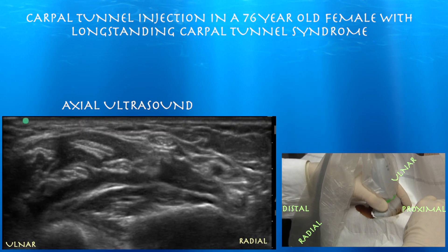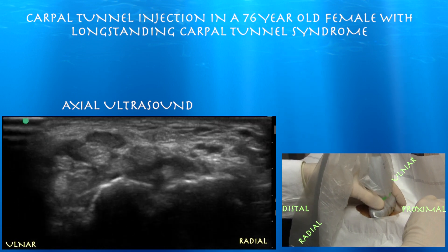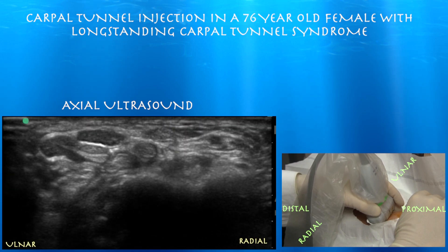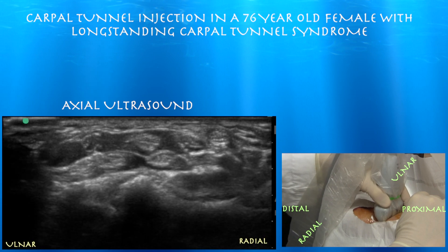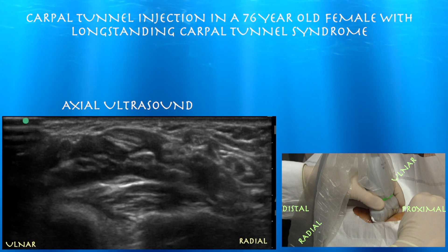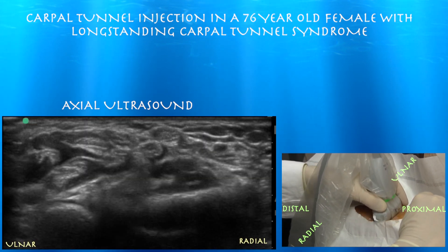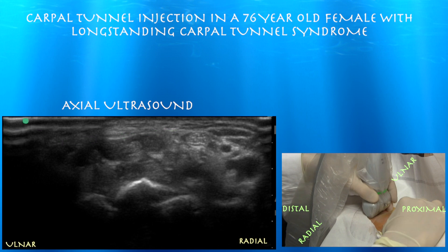Back towards the wrist, the nerve itself is pretty big. You can appreciate the flexor carpi radialis tendon just to the right, and the flexor carpi radialis tendon and palmaris longus tendon basically form a triangle with the median nerve. The flexor digitorum superficialis and profundus tendons are right below that, and the pronator quadratus muscle forms the floor of this whole flexor compartment beneath all those flexor tendons, going from the radius to the ulna. You can make out the flexor retinaculum as well — just a thin little layer above the median nerve.